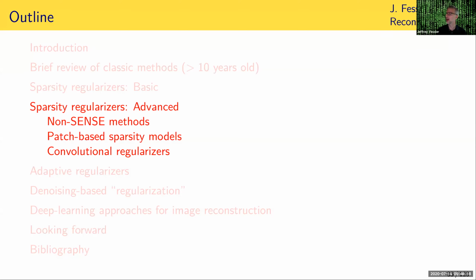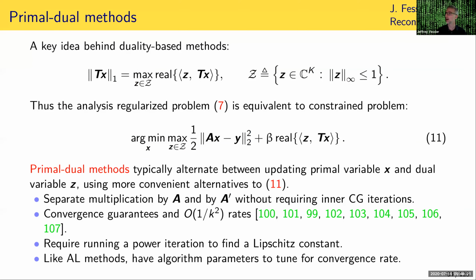Okay, somebody's asked the question, is x in Rn or Cn? So in MRI, x is always in Cn. In the image reconstruction problem in MRI, the transverse magnetization is a vector that has an i and j component, and we represent that vector using complex numbers in MRI. And in fact, it's not just a mathematical representation. The scanner itself, the receive coils go through I and Q channels, so there really are 2 A to D converters collecting an in-phase and quadrature component. There's 2 streams of numbers, and it's most natural to associate those 2 streams of numbers as the real and imaginary part of complex numbers. And the whole Fourier way we're writing it down is assuming that.